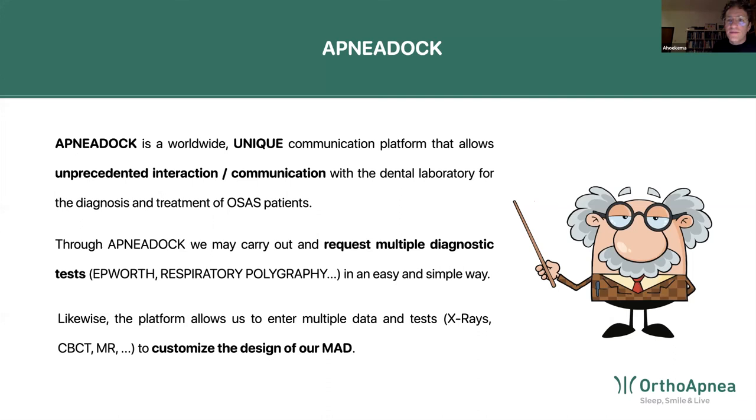So the thing is that if you feel that 10 millimeters by default is too much, you just tell the lab, okay, I want my patient to be able to open 3 millimeters, 2 millimeters. And the lab will design the cam to allow only 2 millimeters of mouth opening, for example.